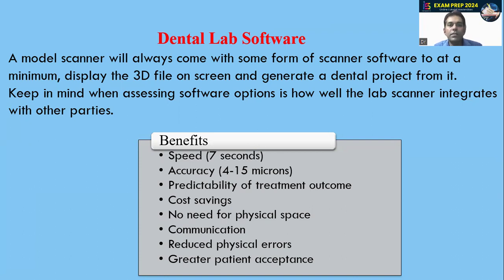Now, regarding the benefits of lab software, there are several benefits. First of all, the speed of the lab software, then accuracy is very good, predictability of treatment outcome, it is cost saving, no need for physical space, the communication is very easy, one can communicate with the laboratory technician, it reduces physical errors and greater patient acceptance is there.